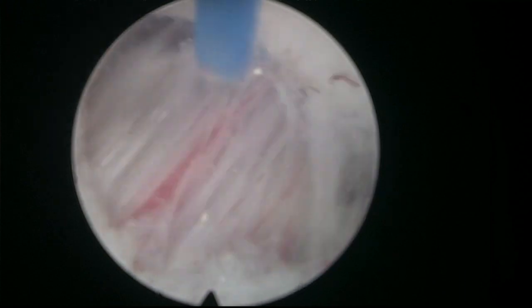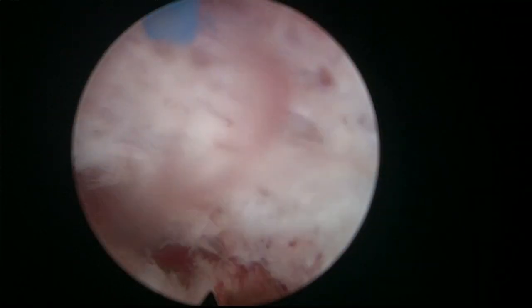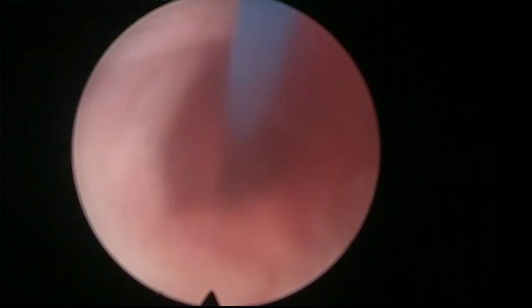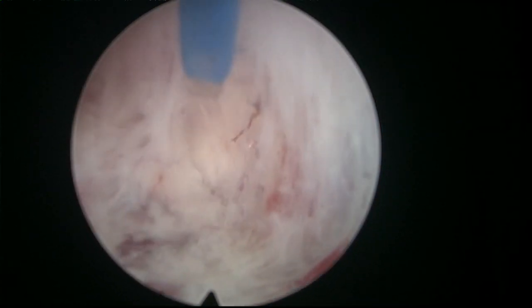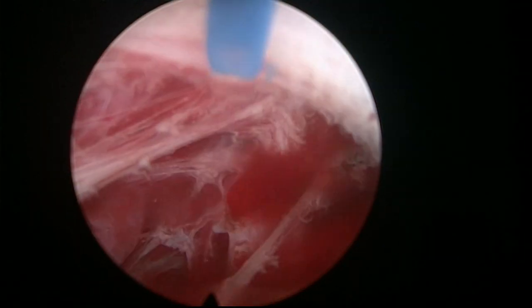plexus, follow the plane. Ah, here we see circular fibers again, this is the bladder neck. Here we see vertical fibers, this is the entrance to the bladder. Now we open some vessel, which is bleeding on our face. If you see that everything gets red, you shouldn't be afraid. Most likely there is a single vessel bleeding on your face, you know what I mean?